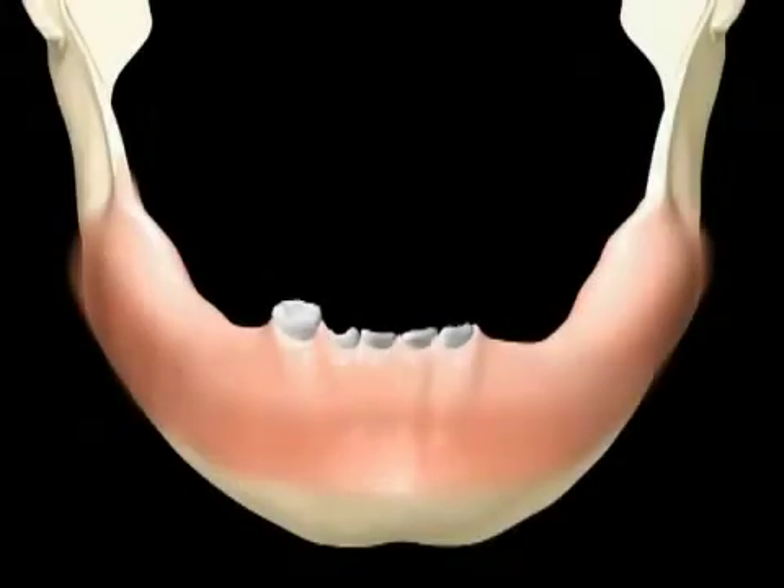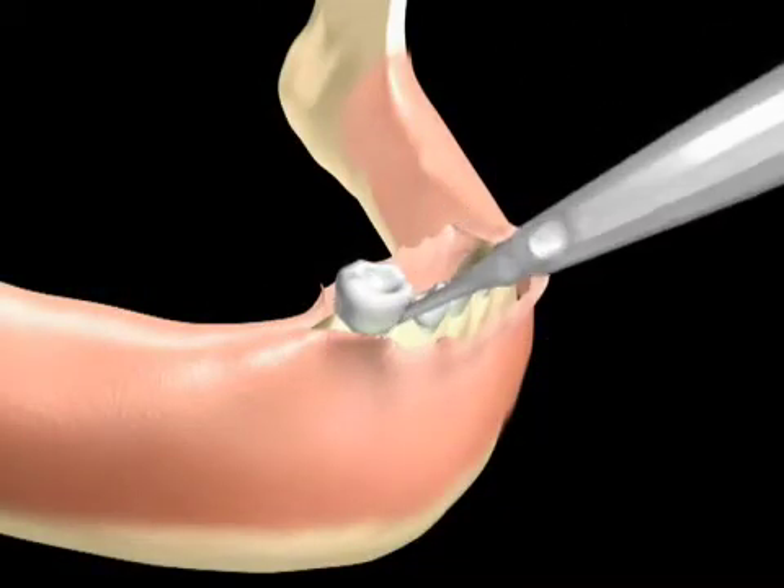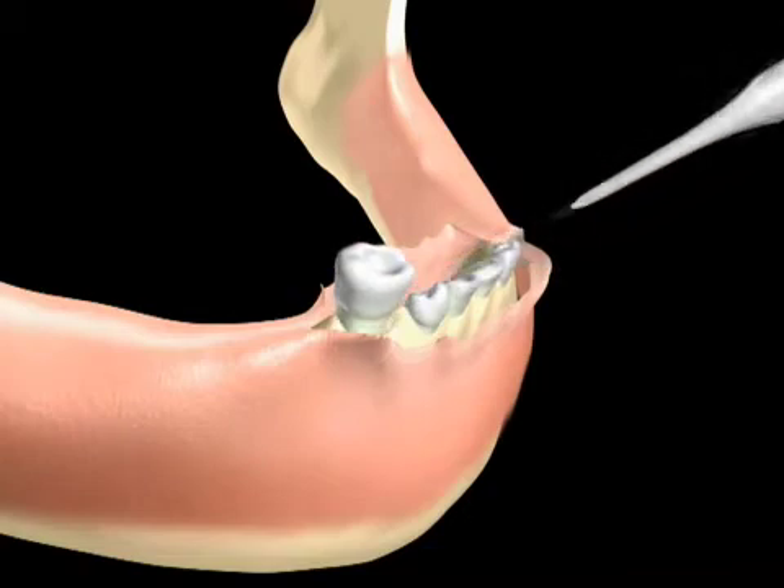In this instance, the remaining teeth are either clinically compromised or will be removed for the strategic purpose of obtaining cross arch stabilization.